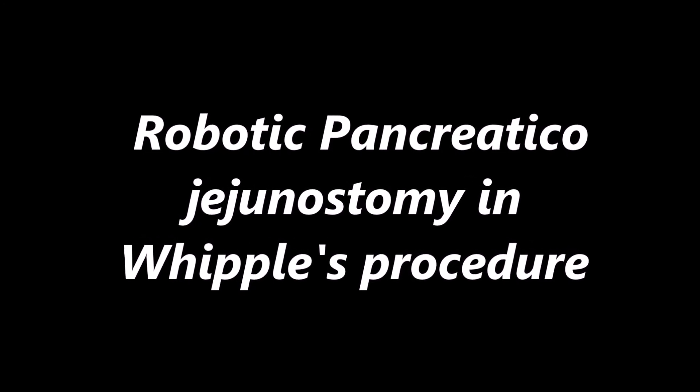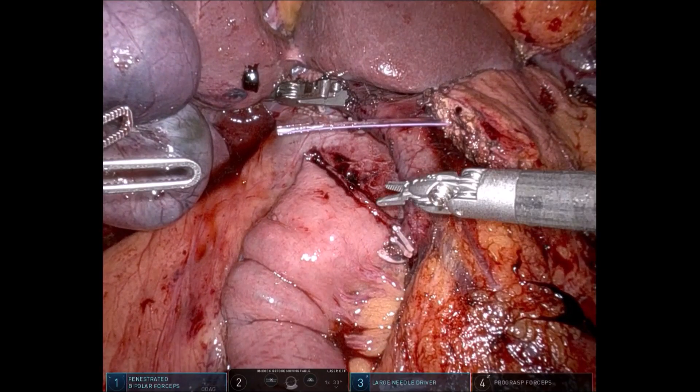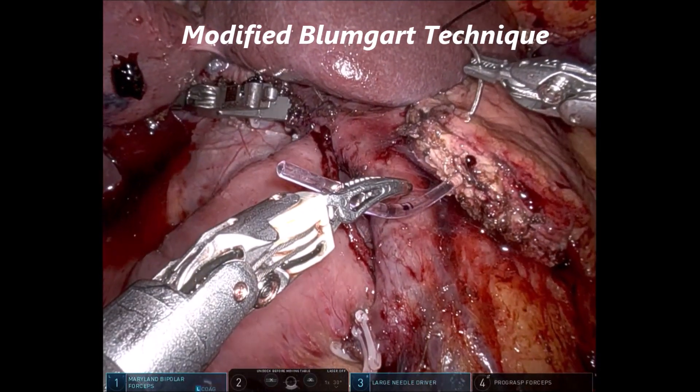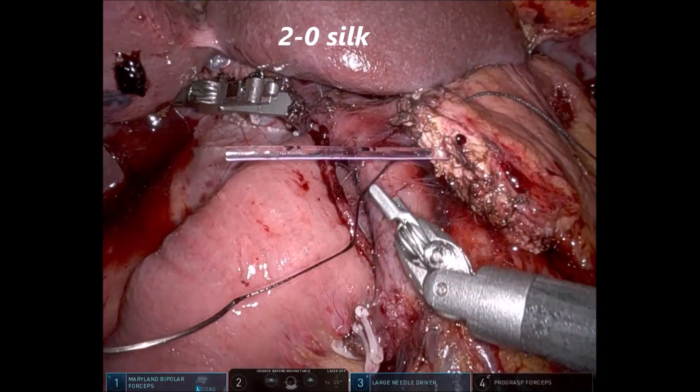We are seeing a pancreatic reconstruction with pancreatic ojejunostomy in a robotic Whipple procedure. We use 4 robotic ports and the camera will be in the right paramedian port. We perform this in a modified Blumgart fashion.